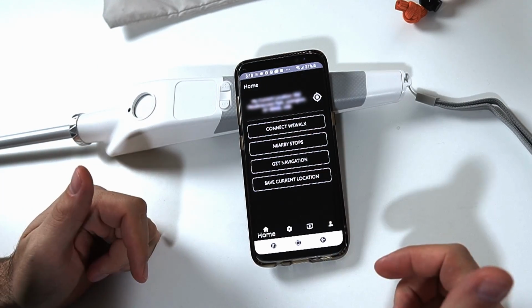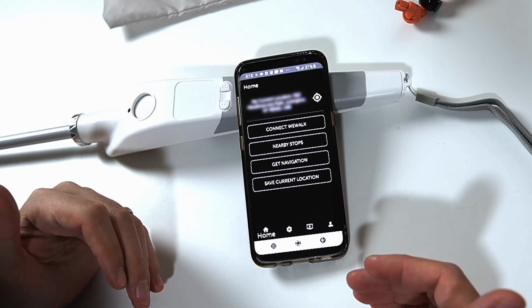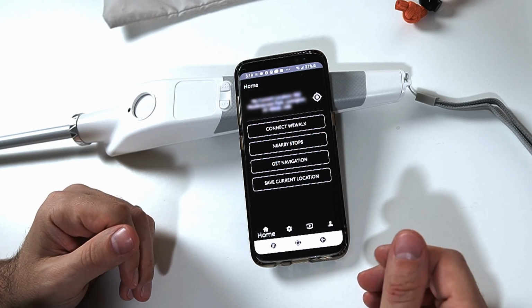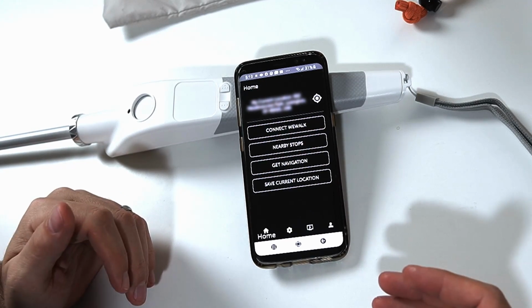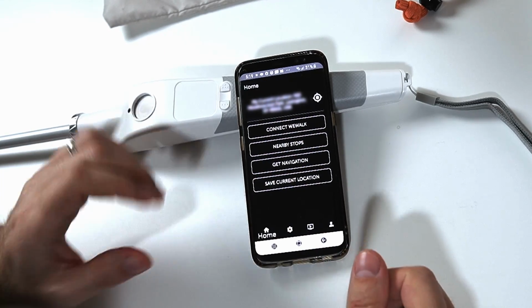So the WeWalk does have an app, the WeWalk app, and of course it is 100% accessible with a screen reader, because that would be ridiculous if it weren't. They also give you some low vision options, so you can invert the colors. This app is normally white with black text, but now I'm running black with white text. You can also run black with yellow text. That's pretty awesome. I do have the font set as high as it can be, the text size, and it's not quite big enough. I would actually prefer it even bigger than it is. But all in all, not too bad as far as accessibility options.